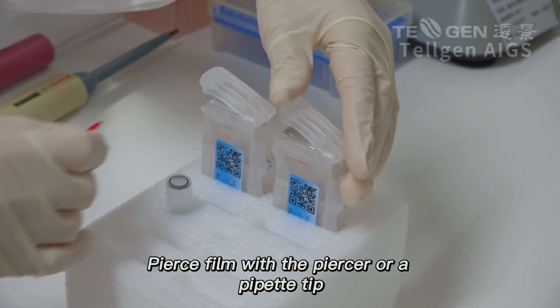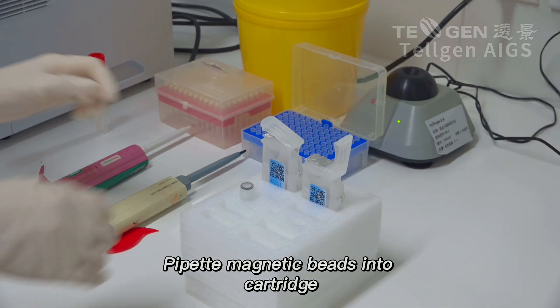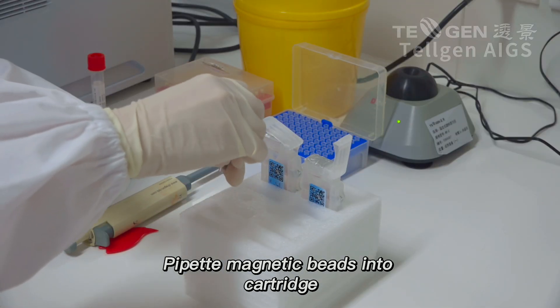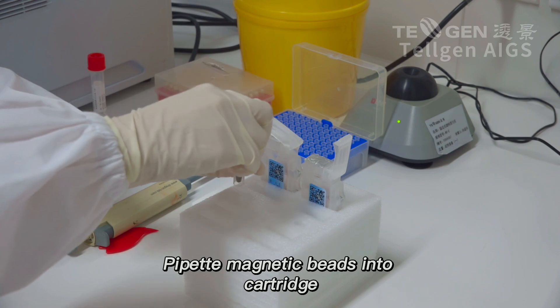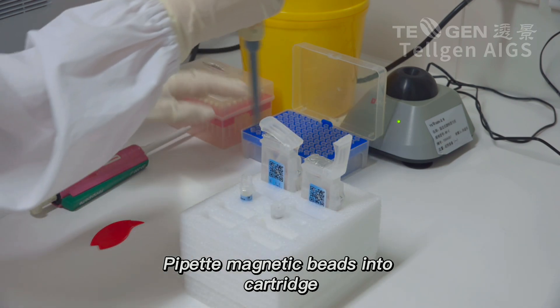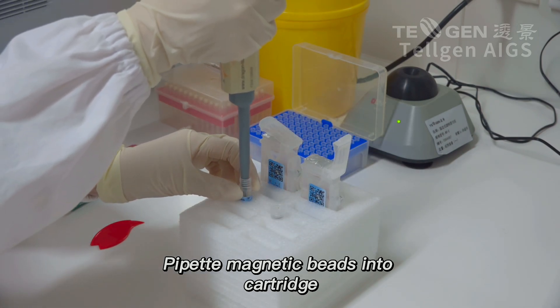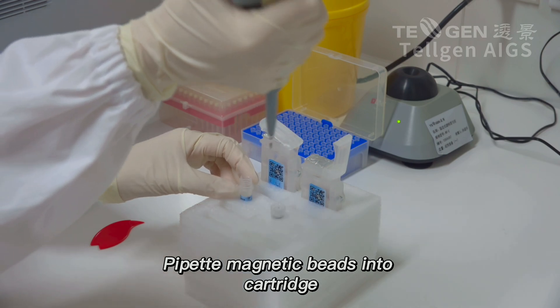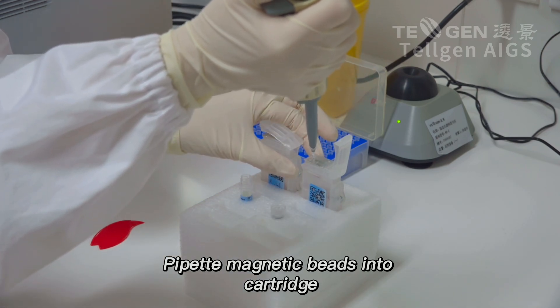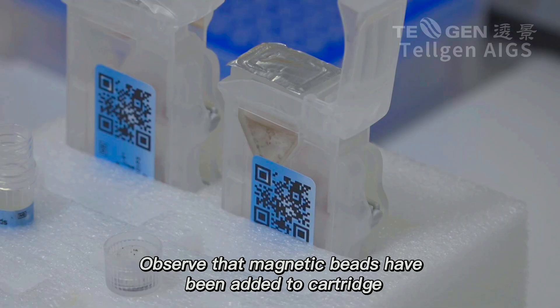Pierce film with a piercer or a pipette tip. Pipette magnetic beads into cartridge. Observe that magnetic beads have been added to cartridge.